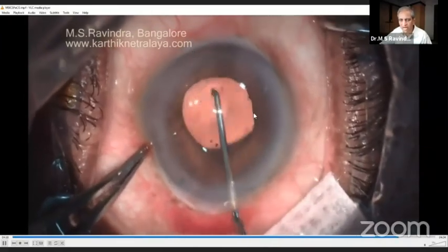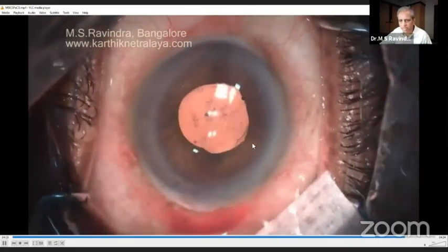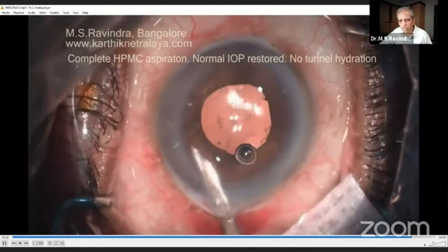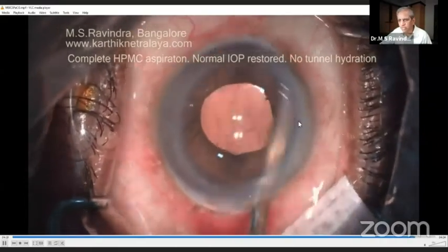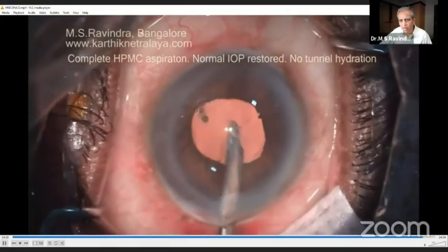I could manage a very hard cataract. I could retain a rhexis there, and I could prevent the complications. With the low pressure, low infusion, low vacuum technique, I'm not further damaging the very small amount of visual field he has, and all are possible.